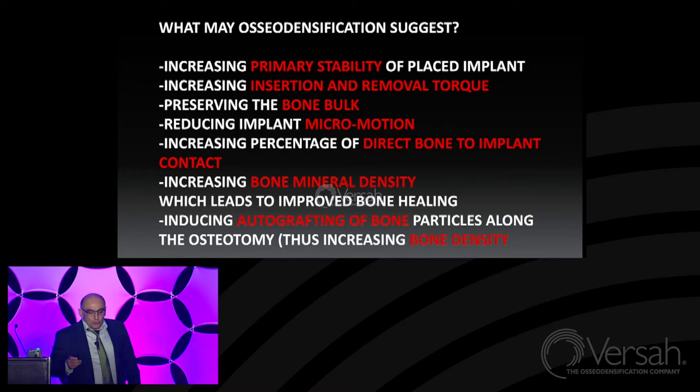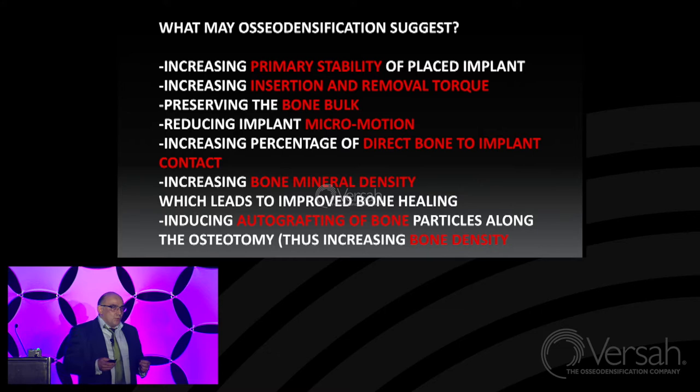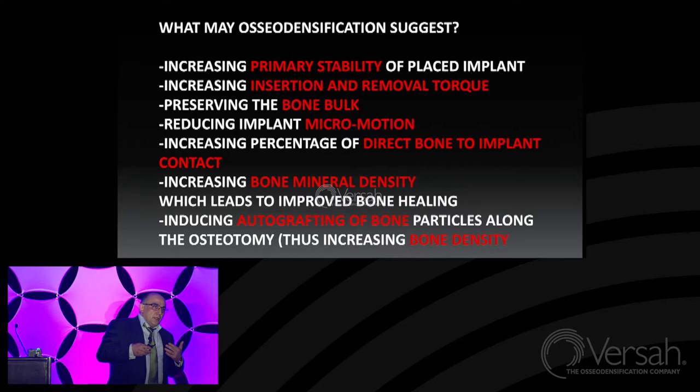We talked about how there are no clues about how much bone to implant contact we will have, but nevertheless, we know, based on theoretical investigation, that we get much more bone to implant contact with this technique. It increases bone mineral density, which leads to improved bone healing, and it induces autografting of bone particles along the osteotomy, which allows more rapid healing of the osteotomy site.